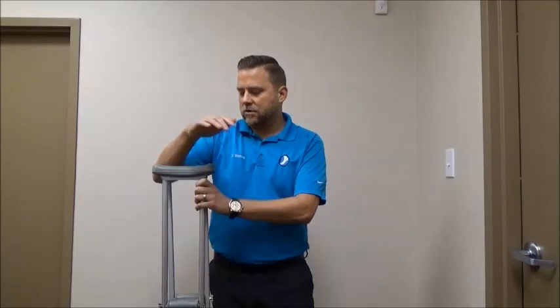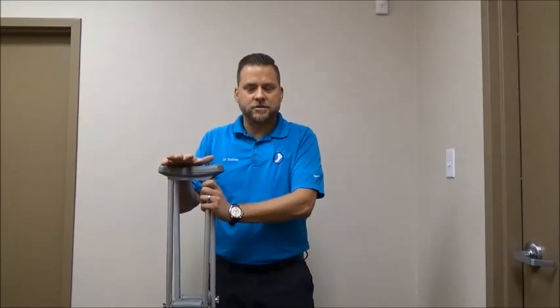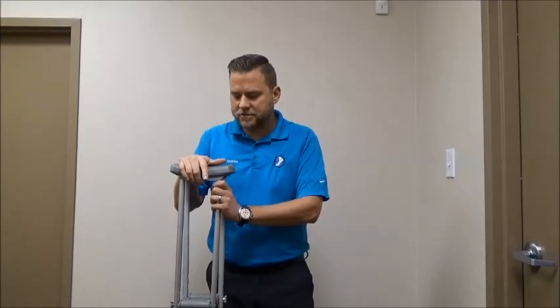Hi, I'm Dr. Paul Steinke from Foot and Ankle Associates of North Texas, and today we'll be discussing the proper way to operate crutches. We commonly have patients who use these after an injury, but especially after a surgery, and it's important that you operate them correctly so you don't injure yourself or anyone else.